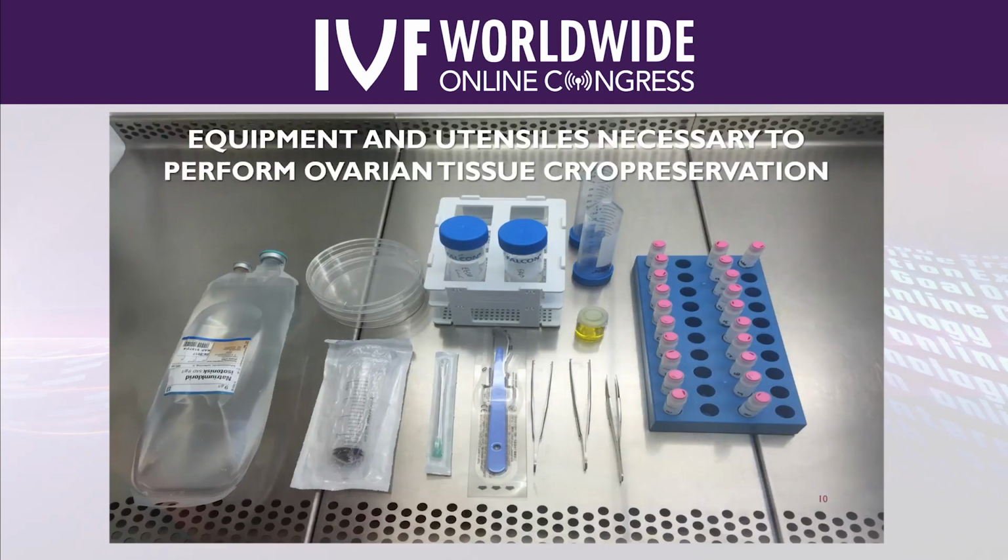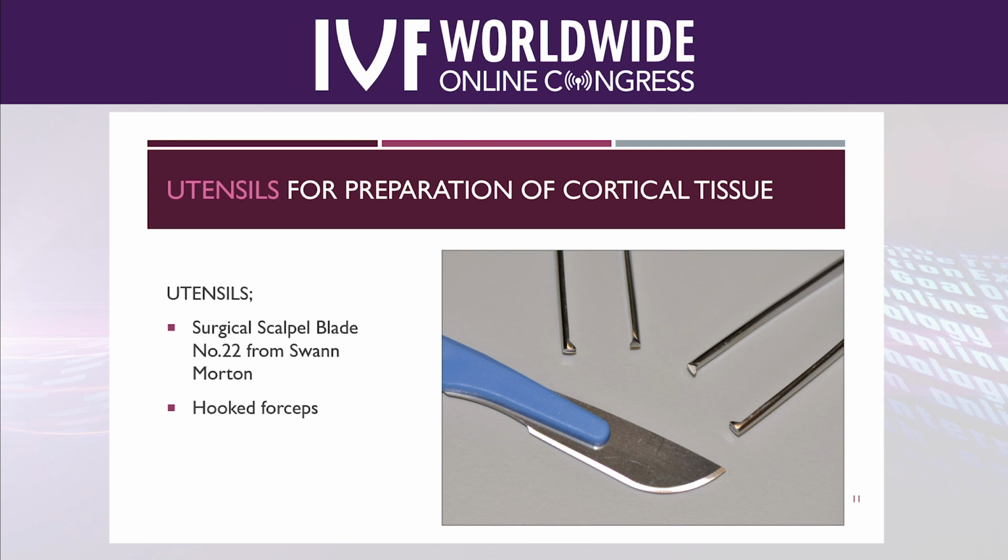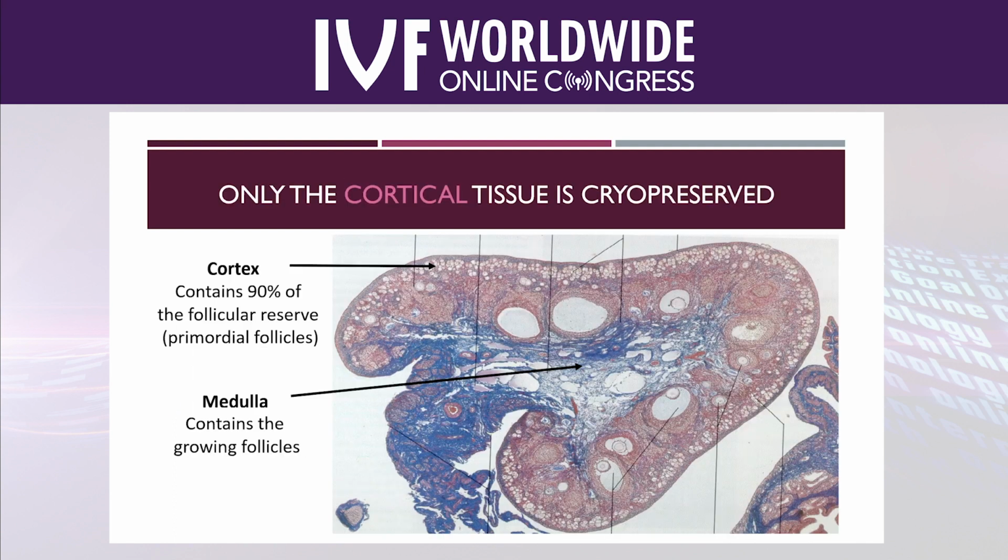In the meantime, we have prepared all of the things that we will use for the cryopreservation. We have the isotonic saline that we'll use to prepare the tissue in. We have the scalpel, the forceps, the ethanol to disinfect, all our cryotubes, and a little bit of fixative to take a small piece for histology. I think the most important utensils are the blade, the knife that we use, and these hooked forceps, because they ensure you have a very good grip on the tissue when you make the preparation, and you can see this in the videos in a bit.